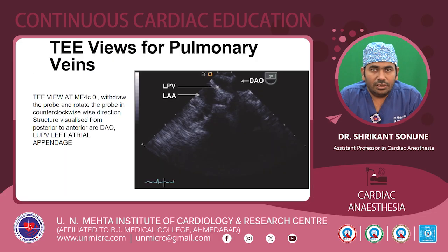And so, coming to the TE views for the pulmonary veins. This is a TE view attained at a mid-esophageal 4-chamber view at 0 degrees.